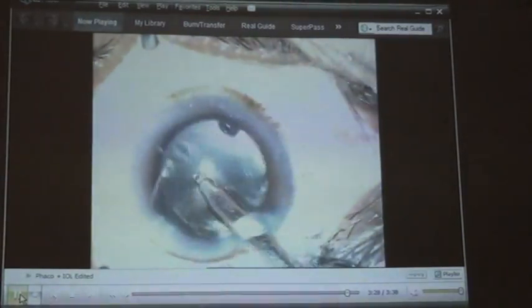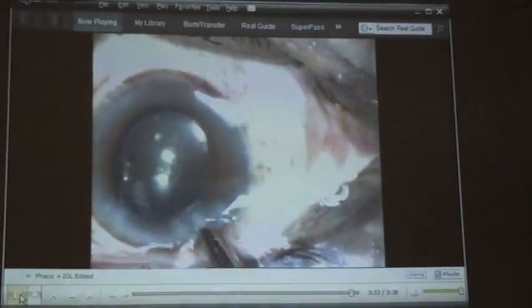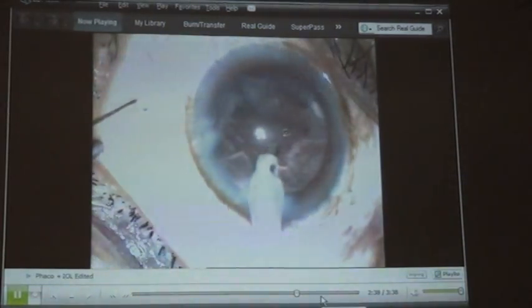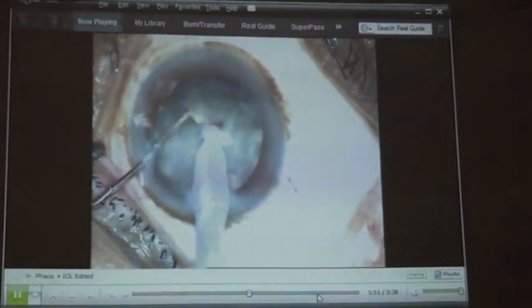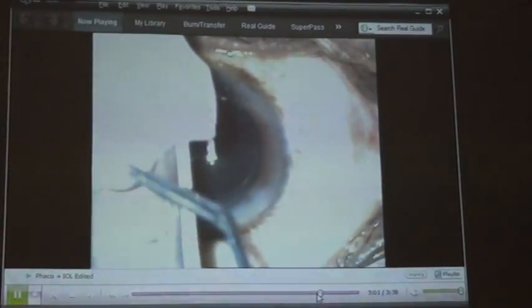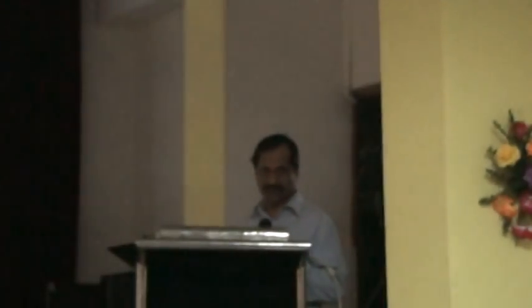Before entering the presentation that was presented, I would like to emphasize that sometimes during all these phases of surgery, this posterior capsule may get ruptured. So this is the situation when there will be not only an anterior opening but also an opening in the posterior capsule. So there is no support for the intraocular lens to implant.